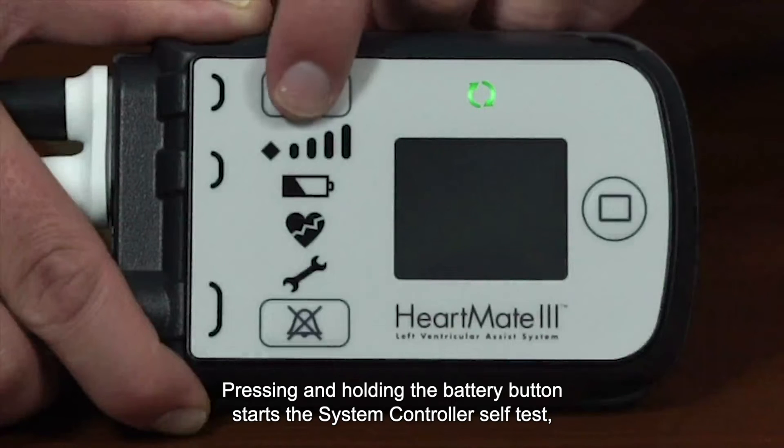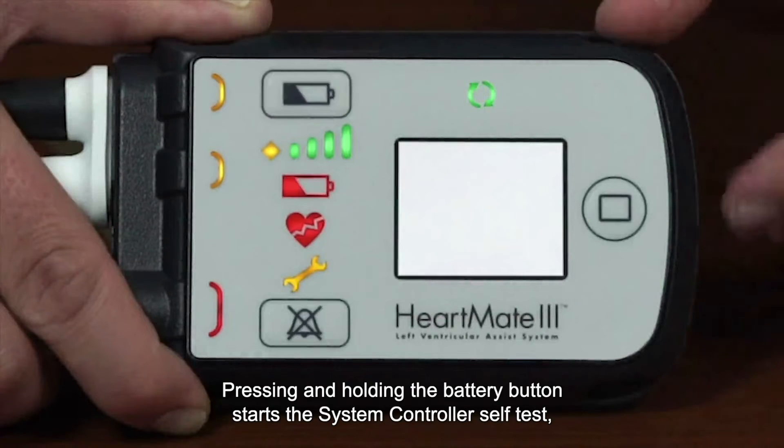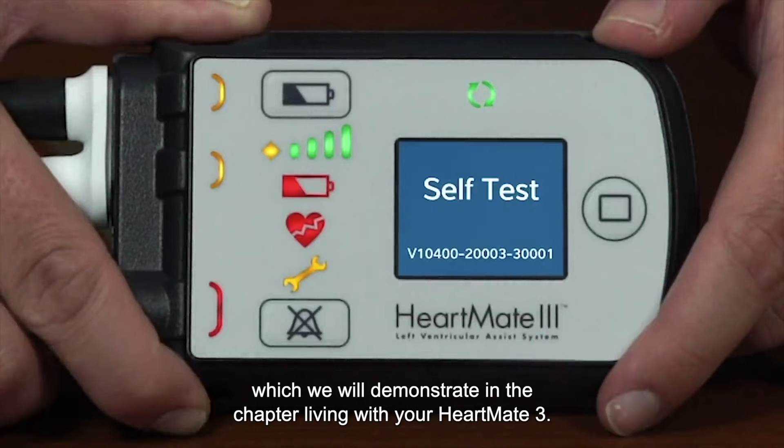Pressing and holding the battery button starts the system controller self-test, which we will demonstrate in the chapter Living With Your Heart Made Three.